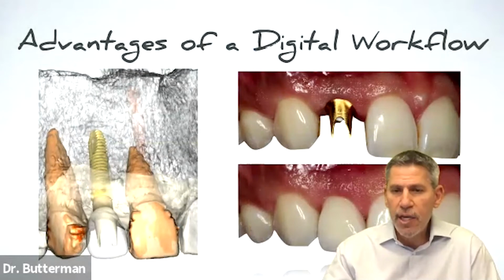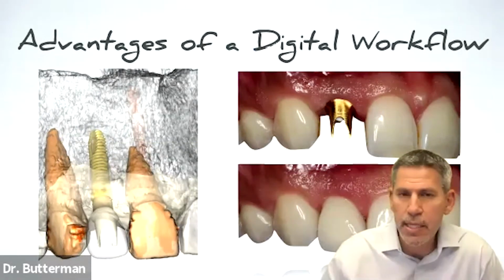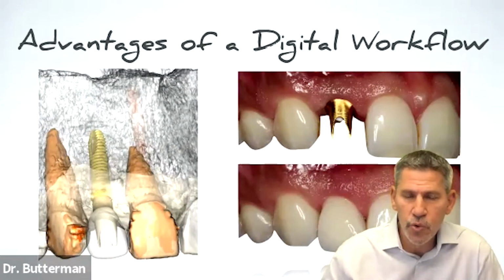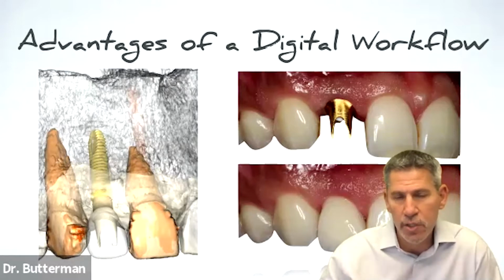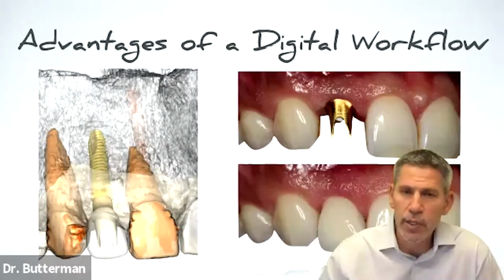So what are the advantages of a digital workflow? And really, the biggest advantage for me is that it's going to be predictable. I'm going to understand where my final restoration is going to be before I ever touch the patient. The patient's going to have an understanding of what compromises we'll need to make because of their biology.